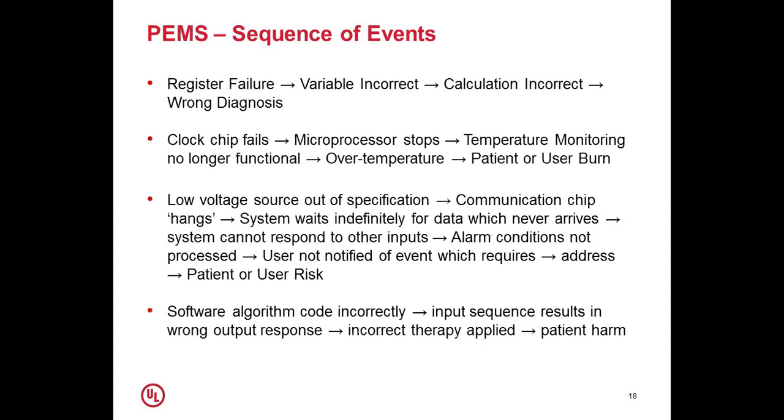Further, if I am looking at what all sequence of events can happen, you can see here a register failure in a microcontroller can result in an incorrect variable, which could result in an incorrect calculation and a wrong diagnosis. A register which doesn't function. A clock chip fails, which results in the microprocessor stopping work. And if I am using this microprocessor to monitor the temperature, the temperature monitor is no longer functional, which results in the temperature overshooting and the patient or user experiencing a burn.